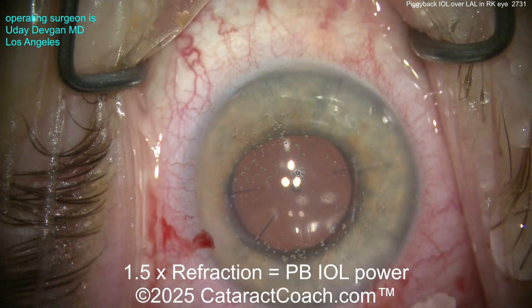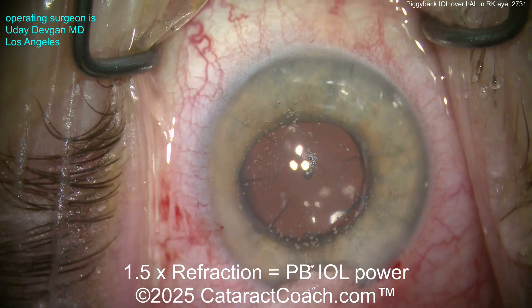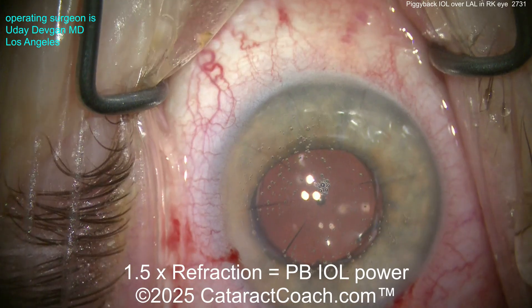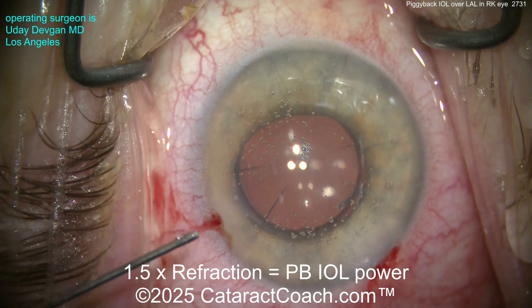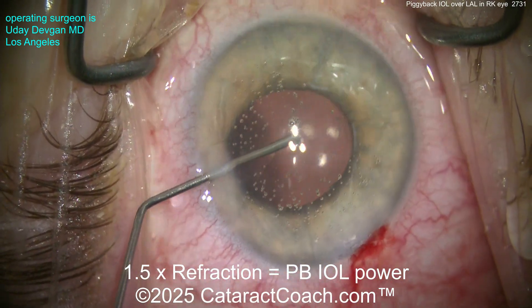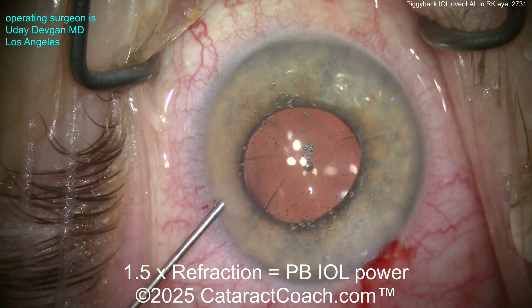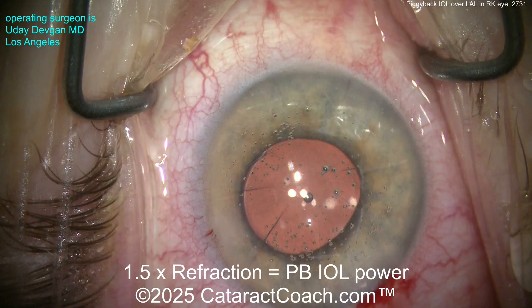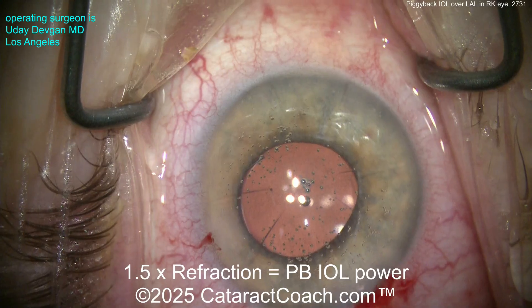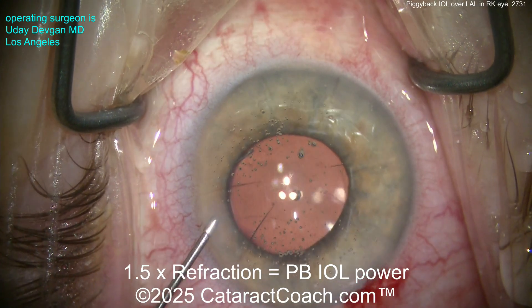Because the patient had prior radial keratotomy, make sure all the RK incisions held up okay as well. The piggyback lens is an easy procedure — it's not that big of a deal. Remember: one and a half times the refraction is your piggyback IOL power. These three-piece lenses for the sulcus are available in plus and minus powers from various manufacturers. In this video the patient is getting a silicone three-piece lens, and they ended up exactly spot on and very happy.